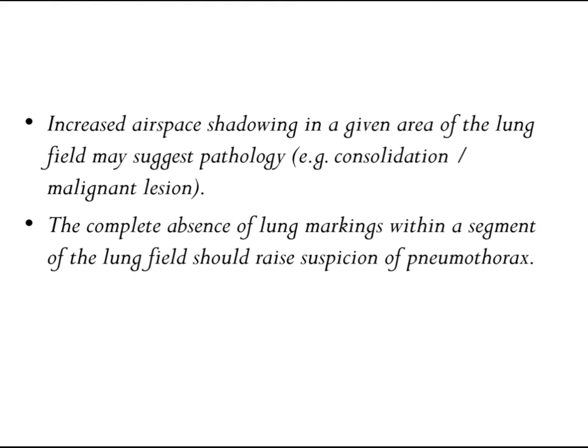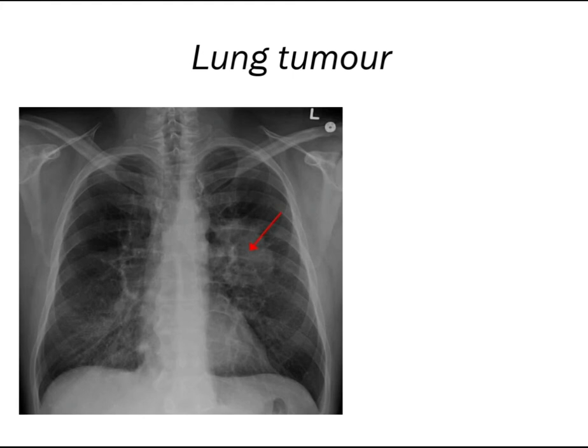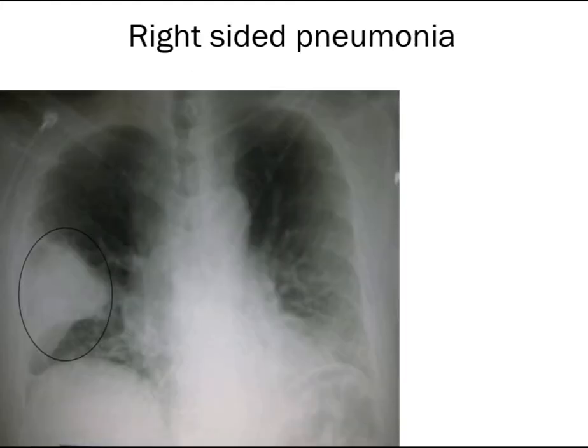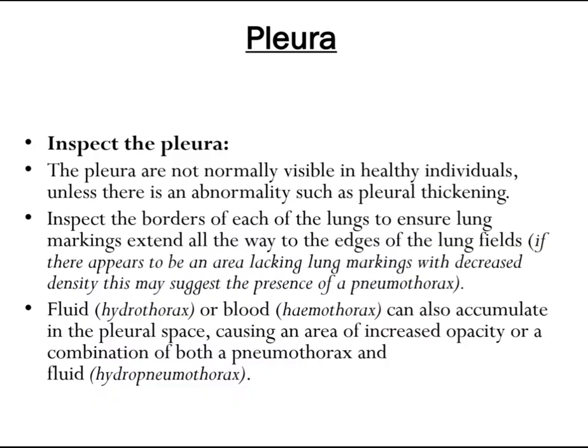Increased airspace shadowing in a given area of the lung field may suggest pathology such as consolidation or a malignant lesion. The complete absence of lung markings within a segment should raise suspicion of pneumothorax. Inspect the pleura — the pleura are not normally visible in healthy individuals unless there is an abnormality such as pleural thickening. If there appears to be an area lacking lung markings with decreased density, this may suggest pneumothorax. Fluid (hydrothorax) or blood (hemothorax) can also accumulate in the pleural space causing increased opacity, or a combination of both (hydropneumothorax).